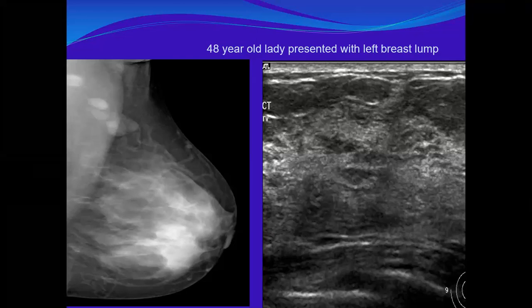In this patient, we went for ultrasound and asked the patient to target the palpable abnormality, and we put the probe. Can you see the abnormality? I can see abnormal breast architecture, which is a hypoechoic area that does not have a certain shape, non-parallel. Yes, so the parenchyma is tenting here, and tethered to the superficial layer of the superficial fascia, pulling it.